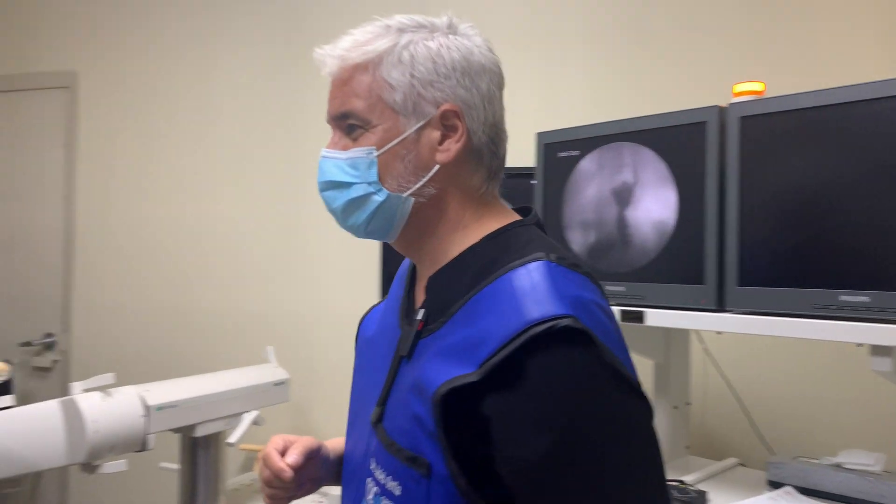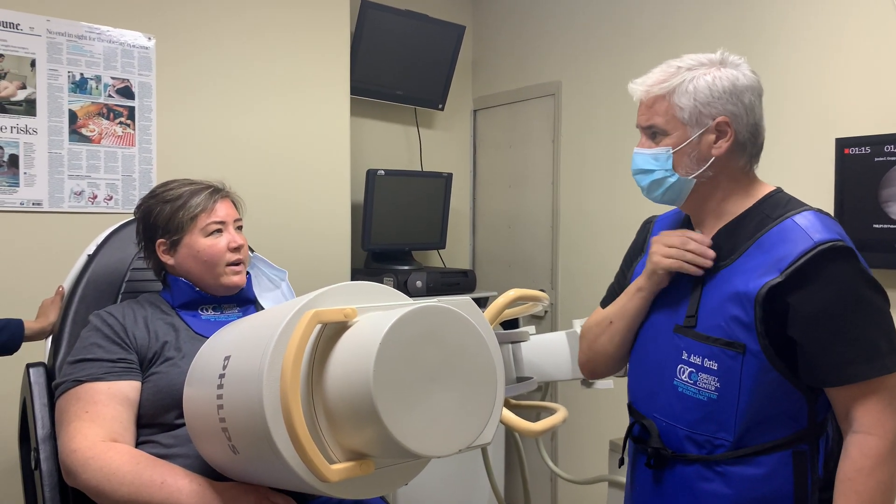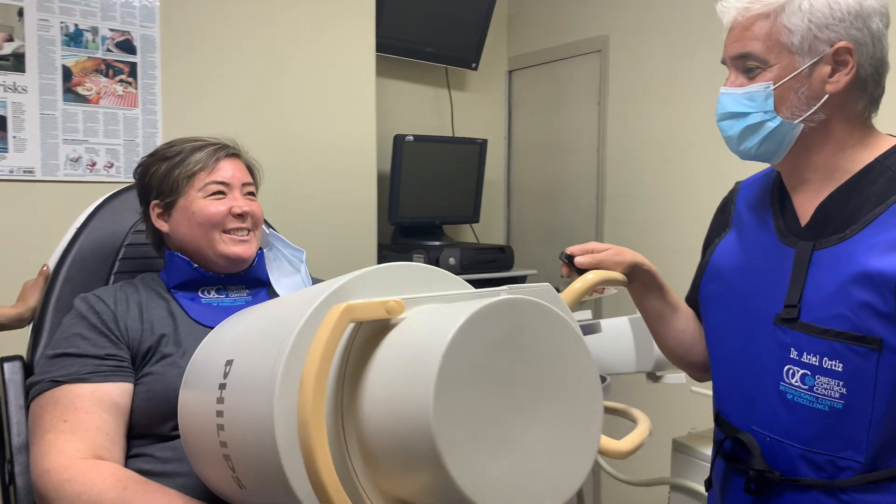How does it feel? I don't feel okay. It doesn't taste good. It doesn't taste good? It tastes terrible.